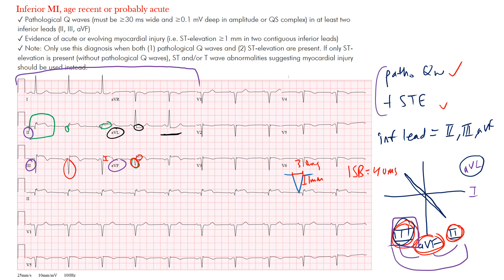So remember, in order to make the diagnosis you need the pathological Q waves and the ST segment elevation. If it's just the ST segment elevation without the Q waves, we would call this a myocardial injury pattern. We're calling it an inferior MI, age recent or probably acute, because you have the Q waves together with the ST segment elevation. The inferior leads are II, III, and AVF — you want two contiguous leads showing these findings.